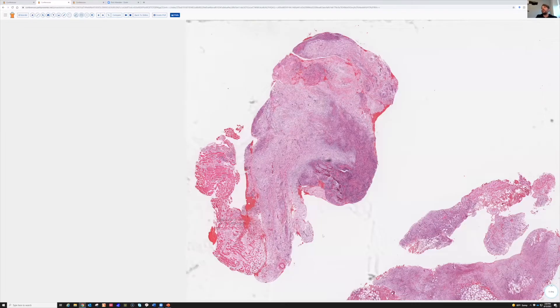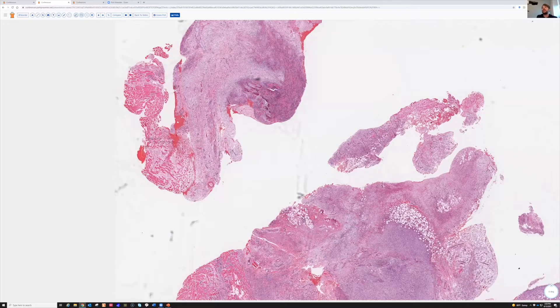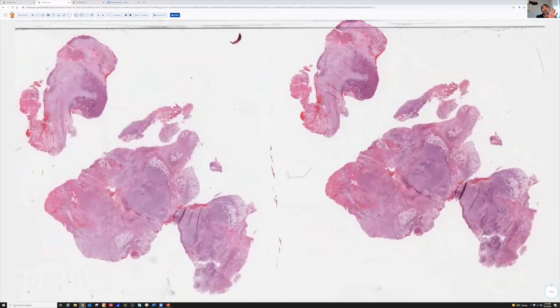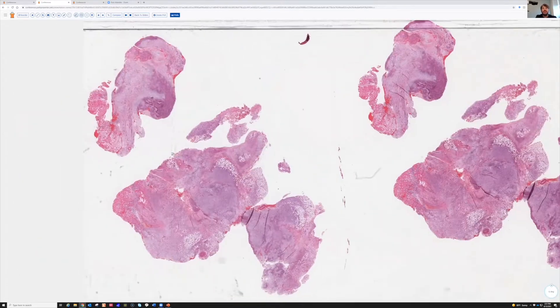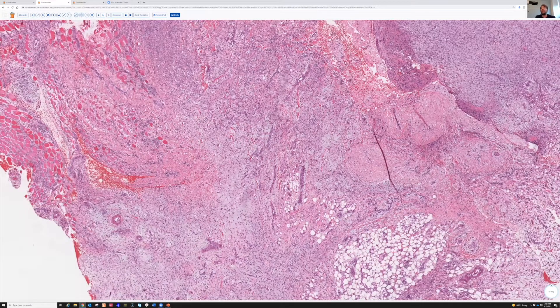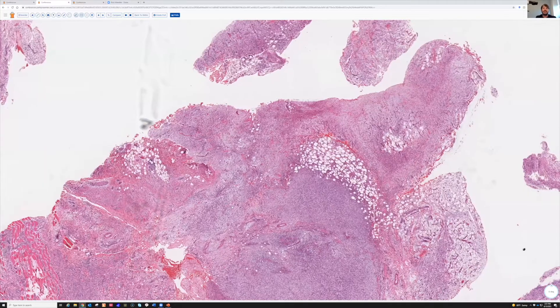Here on the left is what this lesion looked like around the time of biopsy. Even though it looks connected to the bone, from an alternative view you can see it's actually centered in the soft tissue. It's a ring of bone with a lucid center but a rim of radio-opaque mineralized bone around the outside - like an eggshell of bone. When you have that in the middle of muscle, and on pathology you see loose myxoid change almost like nodular fasciitis, plus atrophic muscle, plus a shell of reactive bone being laid down around the outside - that is perfect for myositis ossificans.